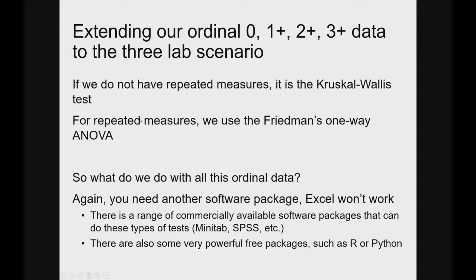Well, sometimes you're going to be working with this sort of data in your lab, and you've got to know how to evaluate it. We can't do it in Excel easily, so you need another software package. Almost anything you find, Minitab, SPSS, Statistica, there's so many out there. They're all going to enable you to do this, and you may even find some freewares that do that. One that I like, actually, that's very powerful is called R.